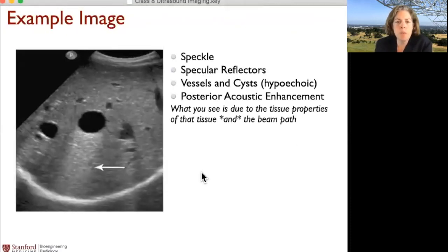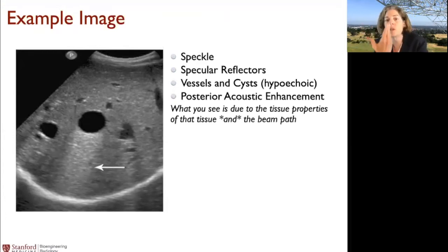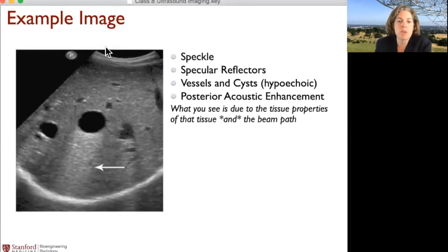Okay, so this is an example image. In ultrasound imaging, it's always as if the transducer is above and you get the picture coming down from the transducer. It's interesting because no matter what the orientation of the body is, longitudinal view or transverse view, the picture is always going to look the same, as if the transducer is up above. It's one line coming out from the transducer, with multiple lines making up the image.